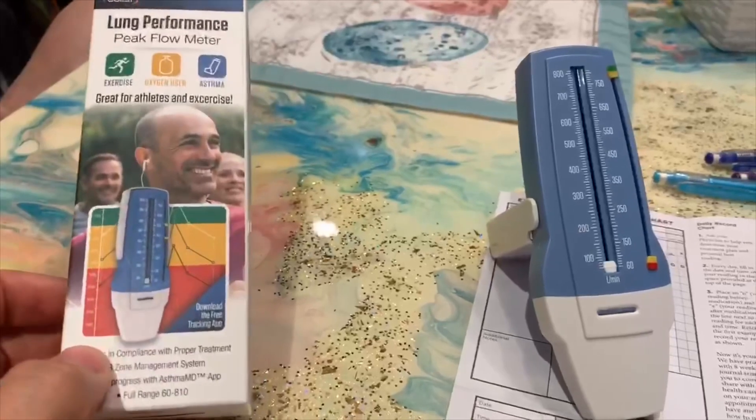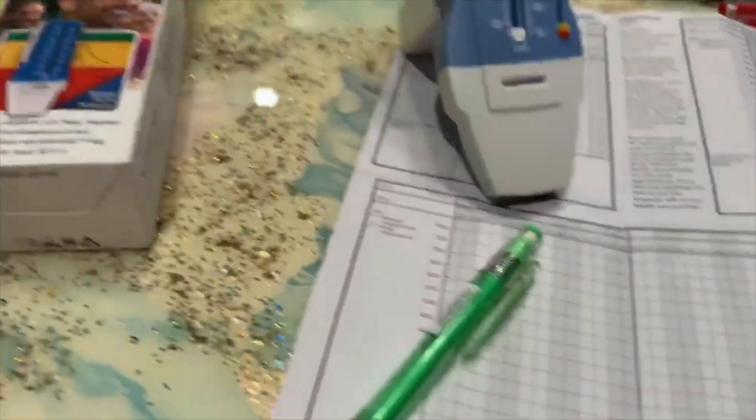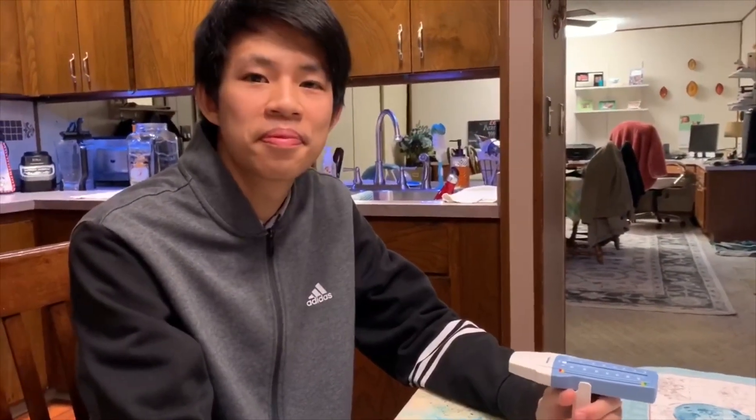We're going to do this once a day, monitoring and charting everyone to see how everybody does. We're going to do three blows on the meter. The biggest thing is you take a breath as deep as you can, try to get a good seal with your lips, and blow as hard and as fast as you can — maximum expiratory volume. We'll take your best of three. Have at it, dude.